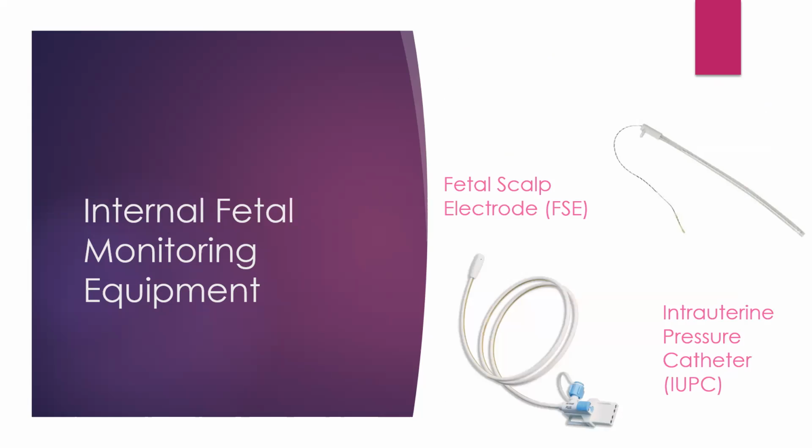Wherein lies the internal fetal monitoring equipment. At the top, you can see an example of a fetal scalp electrode. This is an internal monitor that goes inside and actually inserts into the very thinnest layer of the fetal scalp. That is then able to pick up the electrical activity of the fetal heart and give us a much more accurate presentation of what the fetal heart rate is doing. So if you're having much interference or difficulty monitoring the fetal heart rate from the external environment, we then switch to the fetal scalp electrode.